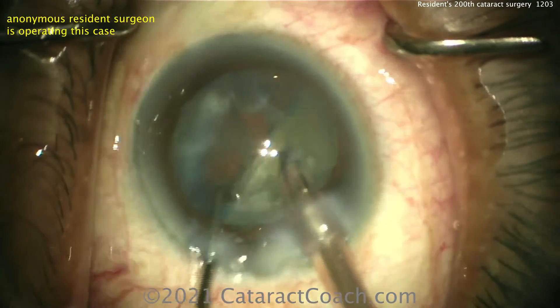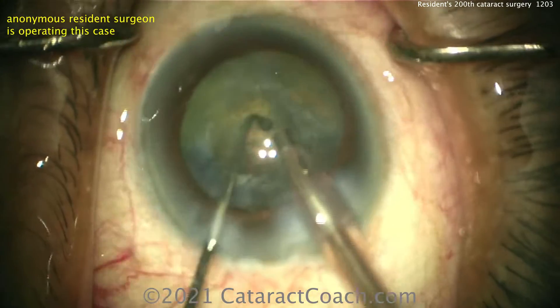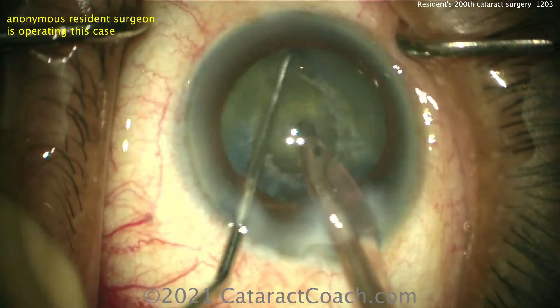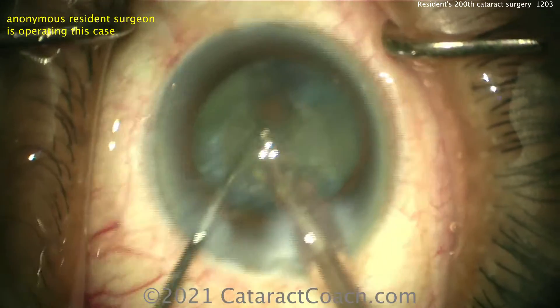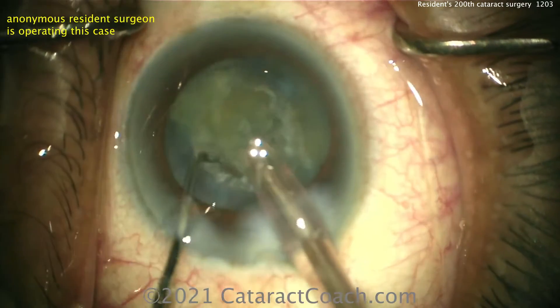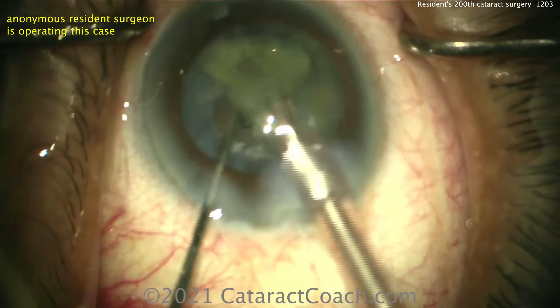You can look at the hydration of the phaco incision — you can see the stromal walls there, that looks pretty good. I would have started maybe just a little bit closer to the limbus for the incision. The chop technique is excellent — very nice horizontal chop here, keeping the eye in primary position throughout the case.